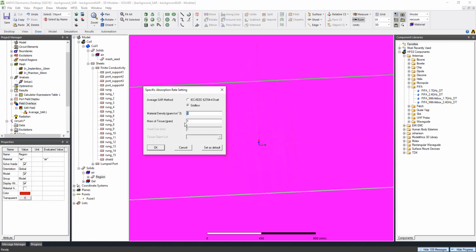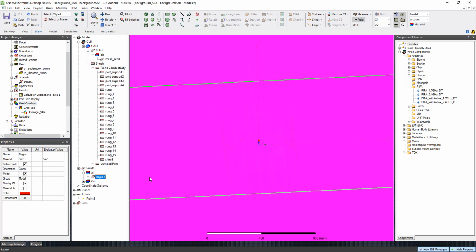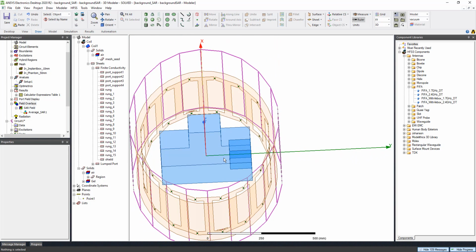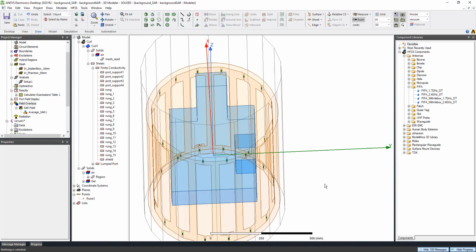So in this case, we can get the SAR over volume over density. Because this two-pass algorithm is very time consuming, when it's trying to calculate the SAR over volumes, it will take up a lot of time. So HFSS uses parallel processing as much as possible to reduce the time in this case.